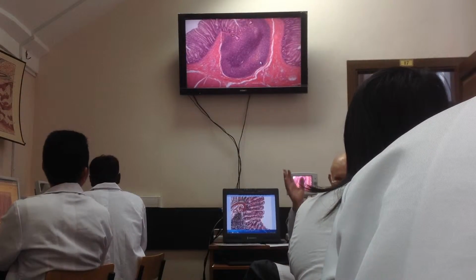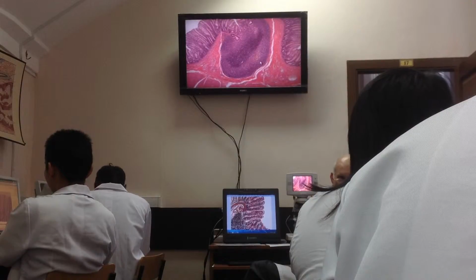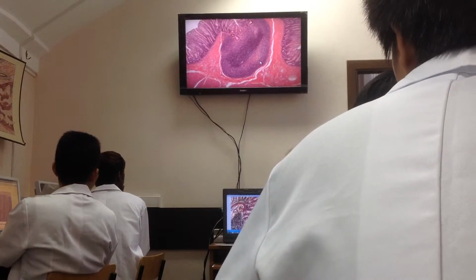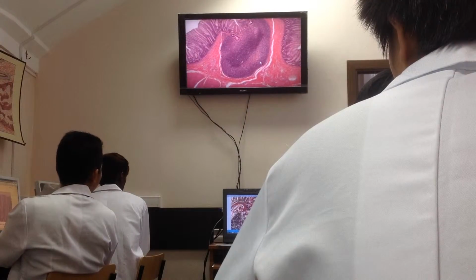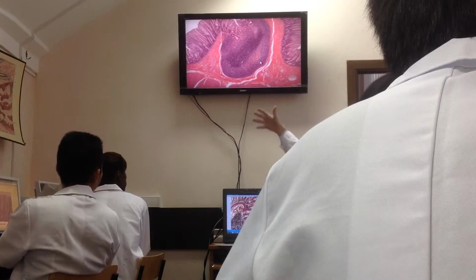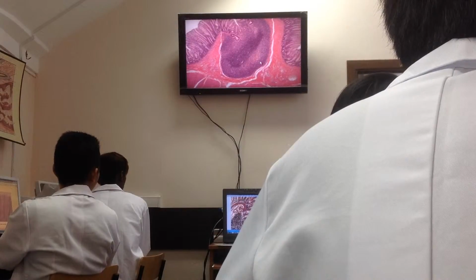respiratory system. Trachea, we examined last seminar. Do you remember pseudostratified epithelium? We will return soon to the respiratory system, and you will see the lymphatic nodule in the trachea too. It's a peripheral organ of immunogenesis. Do you remember? Mucosa-associated lymphoid tissue. So, mucosa and submucosa. The connective tissue contains this group of lymphocytes that participate in immunity.